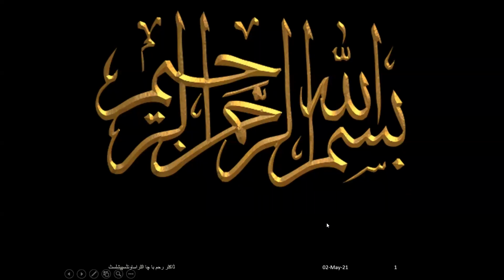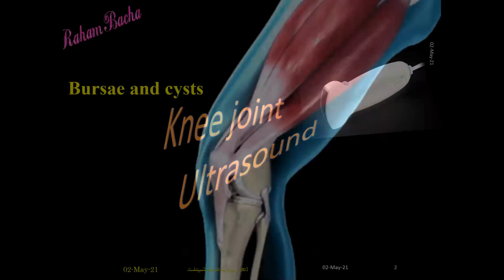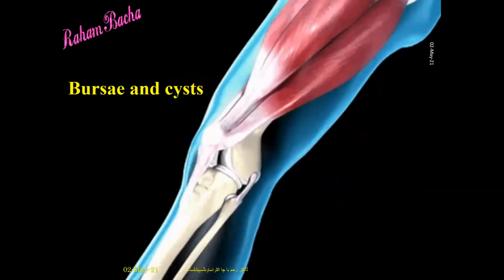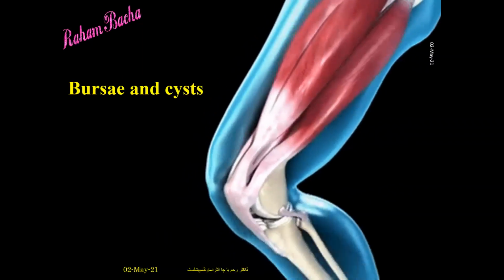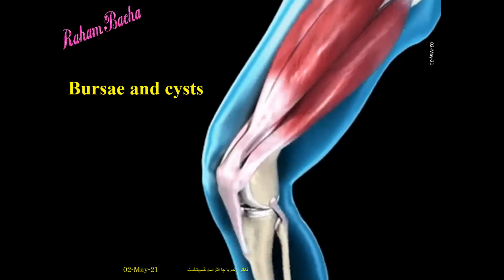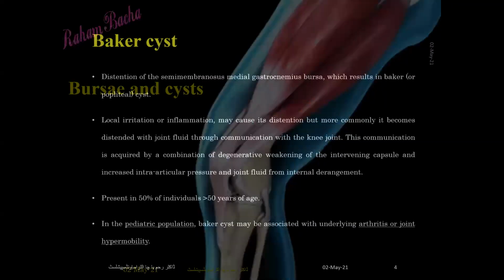Welcome back to the sonographically important knee pathologies. In the last classes, we have already discussed some of the knee joint pathologies, and we are going to proceed further. Here we'll discuss the pathologies related to bursa and cysts.